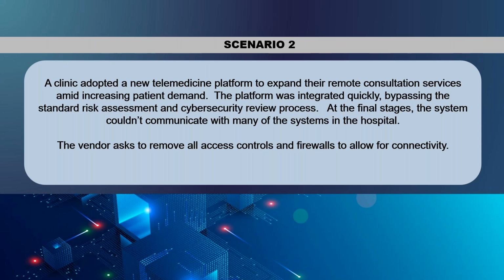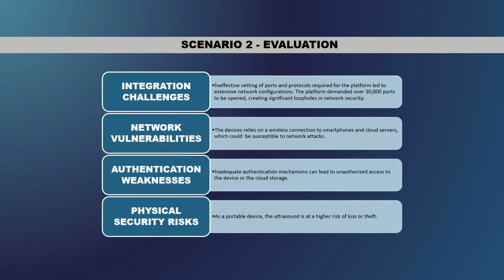So implementing fast is never the answer. Always do your risk assessments properly, because within that time period that those ports were wide open, we couldn't diagnose a problem. Even with nothing blocking them, they still couldn't get access. I was like, well, you're wide open, so at this point I don't know what's blocking your communication. Okay, go to scenario 3.